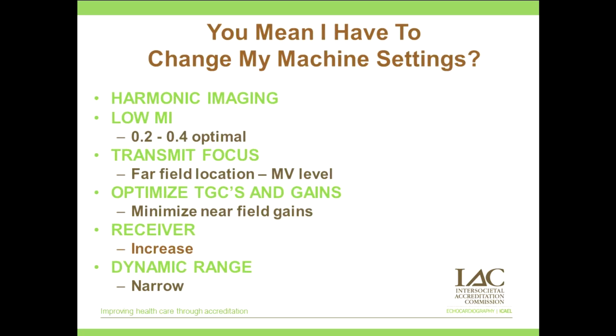And what I suggest, if you don't already have one, is a contrast preset, so you don't have to, every time you use contrast, go in and change all this. A contrast preset is a great idea. So call your system application specialist and ask them to put one in your presets for you. It'll just save you some time.